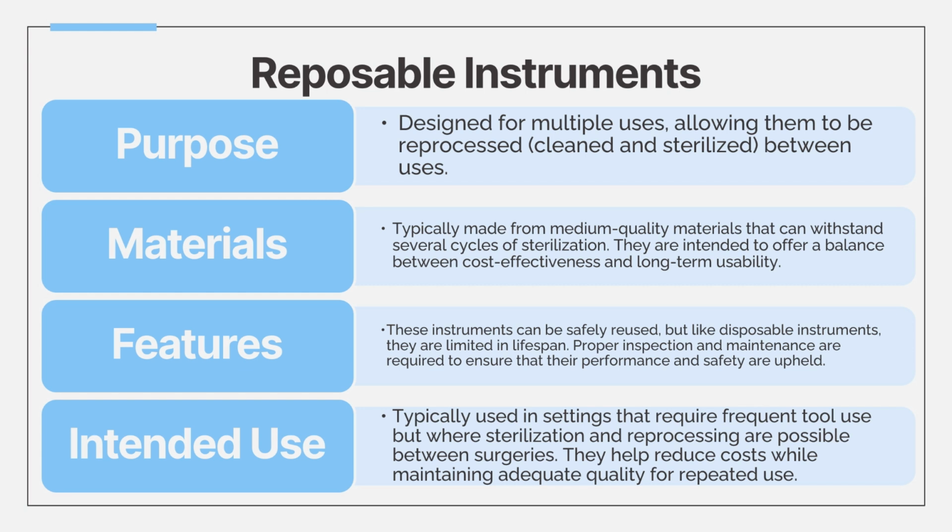It could be that, let's say, it was used 19 or 20 times, and on the 21st time that it was used, it could break down on the surgeon during a surgery, which is obviously not a good situation to be in. So that's why traceability is very important for reposable instruments. They're used in settings where tools are frequently needed and can be reprocessed between surgeries, balancing cost and quality.